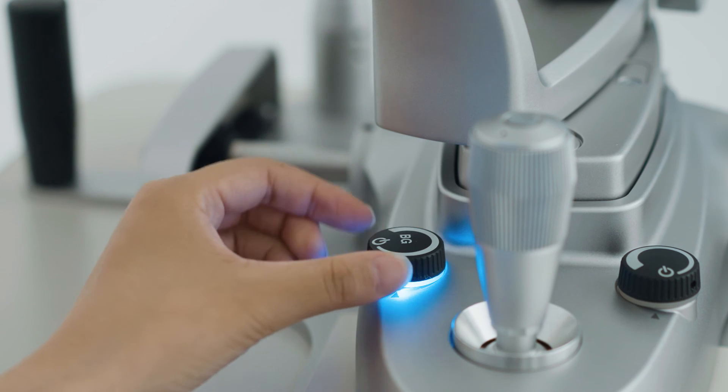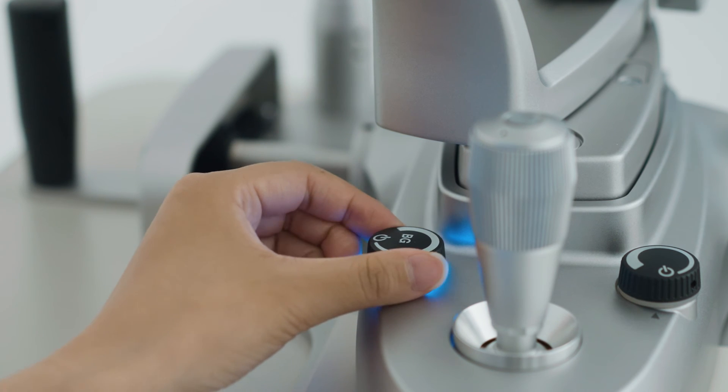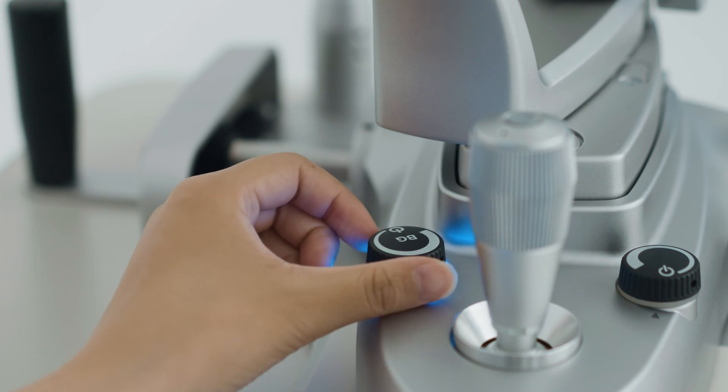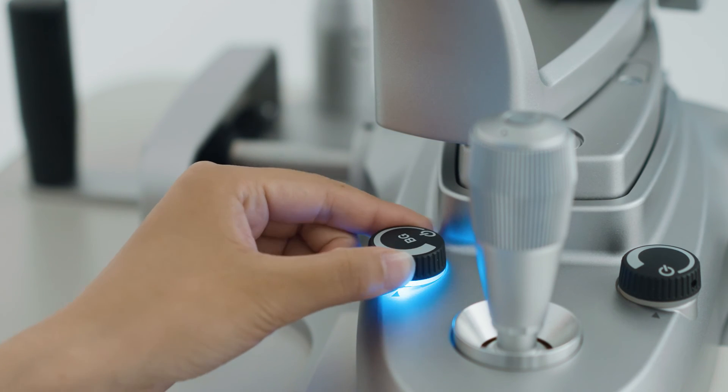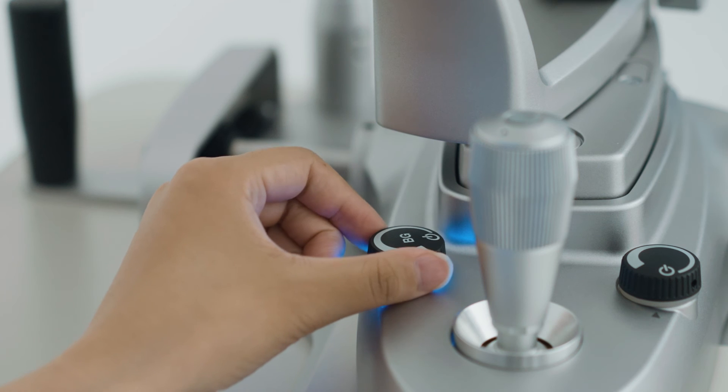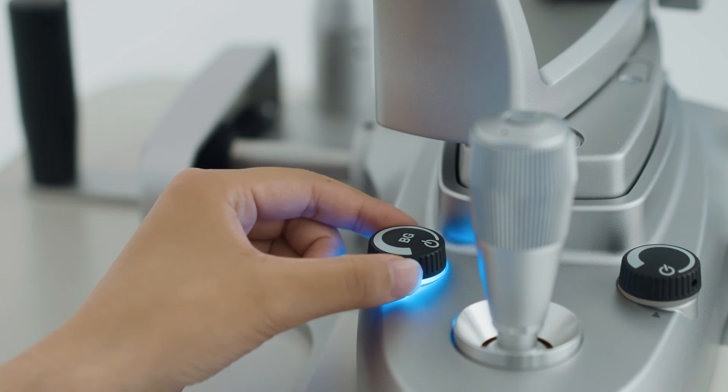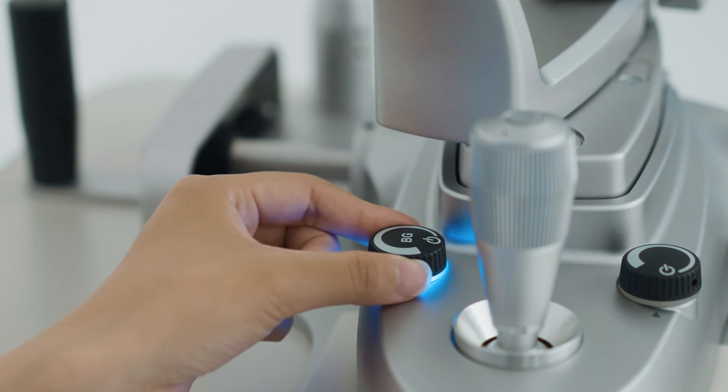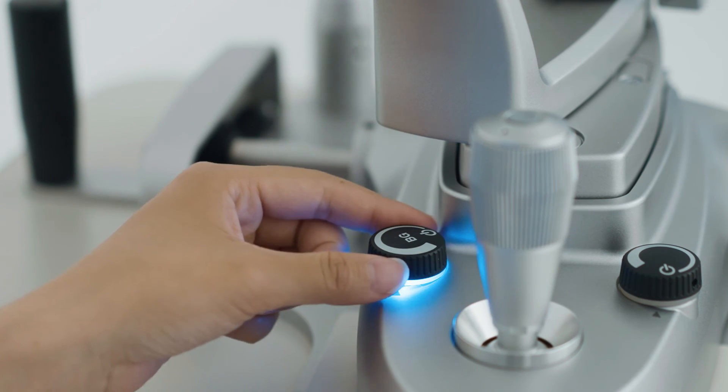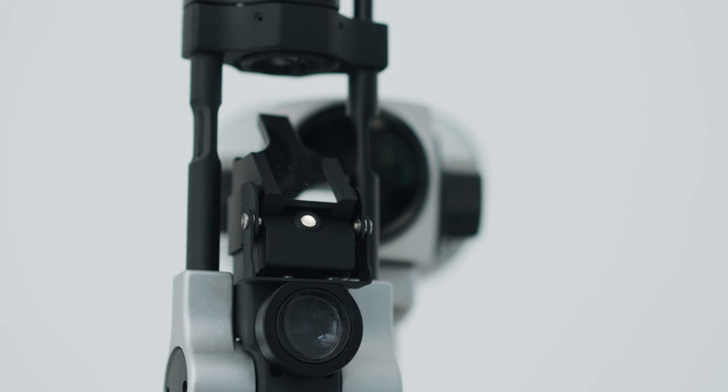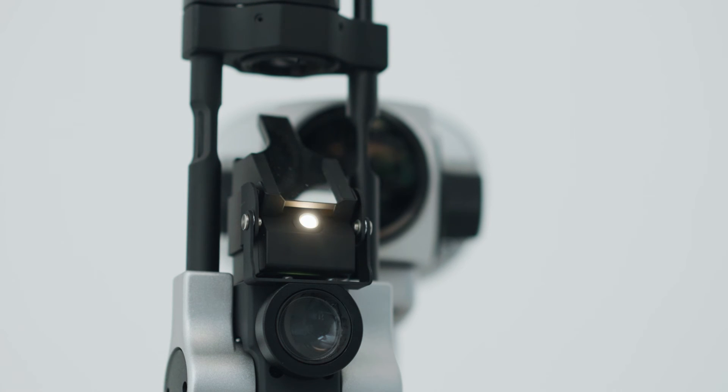A background illumination device brightens the background to capture high-definition observation images. It is included as standard on 700GL and 4ZL.